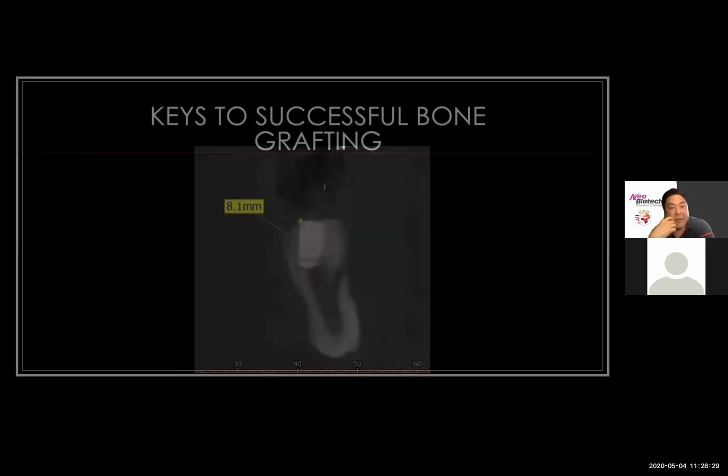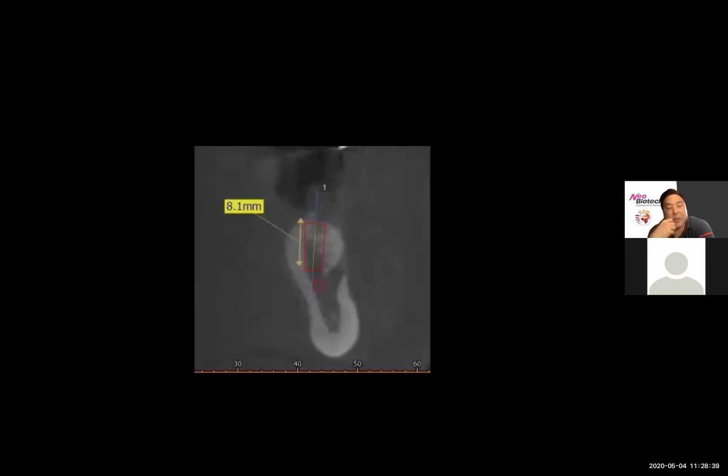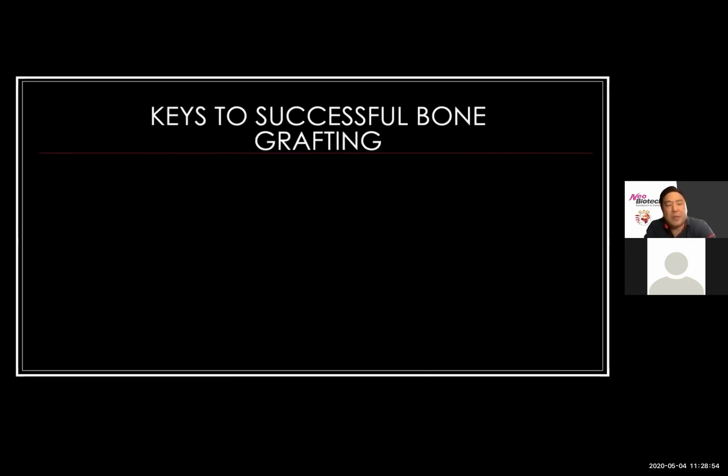And because we have that hard tissue support, we were able to have the regeneration procedure. And in this case, I didn't need to do a soft tissue augmentation procedure because of the amount of tissue that was already present. Now, this patient was referred to me from another office, so he went back after uncovering, and he was having the restoration completed. But we saw him for a follow-up, and I forgot to put the final picture here. I apologize, but we didn't have to do a separate soft tissue augmentation.